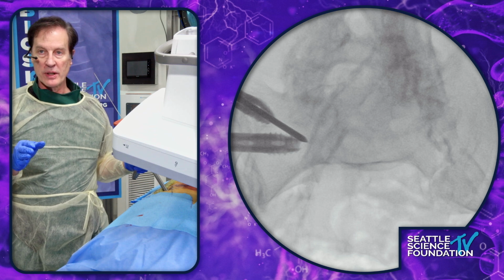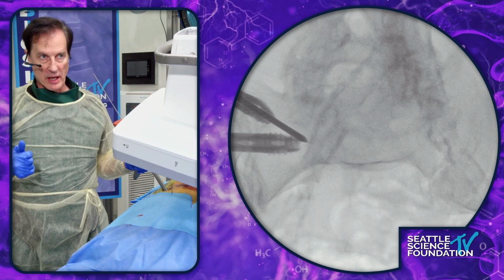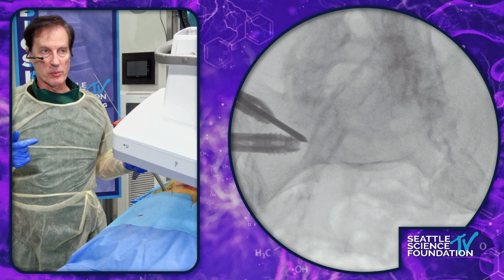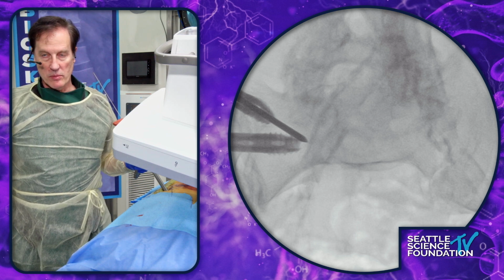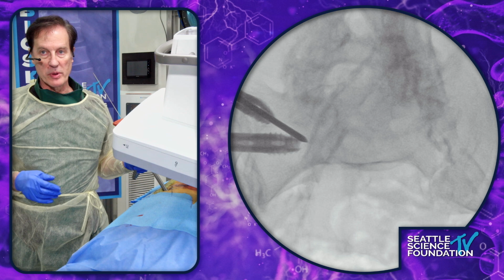And you can see here how the proximal and distal threaded parts of that screw are bridging the SI joint, and the non-threaded portion lies over the SI joint. So lateral based, posterolateral access, and this is using the Genesis system. Genesis has a separate system for a posterolateral approach with a more conical screw, but for the sake of brevity, and because we have this system available to us today, this can also be used posterolaterally.